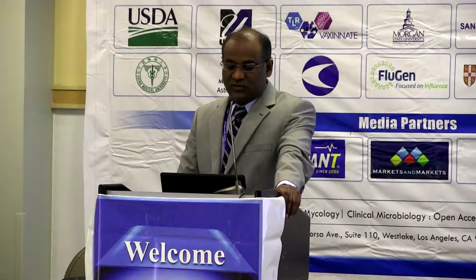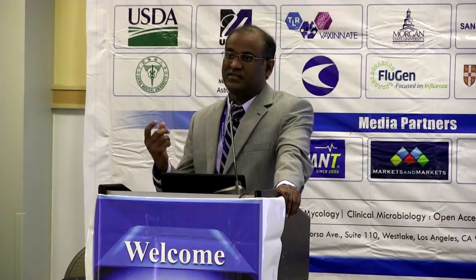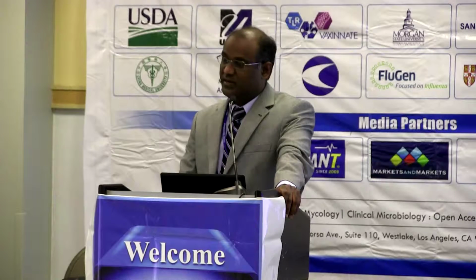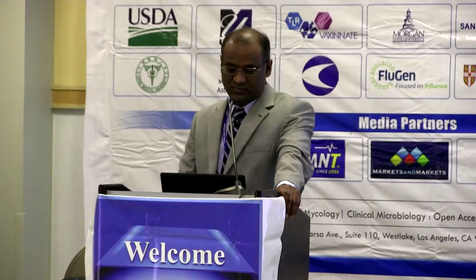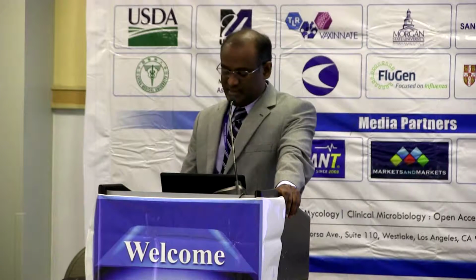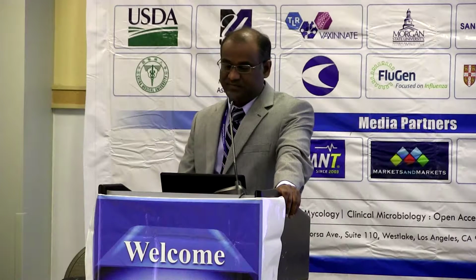Now, there are also cryopreserved shell vials that can be used on demand. So you could get these shell vials, freeze them, and pull them out of the freezer as you need them. And they too have very good sensitivity and performance criteria. Now, these are options for small-volume laboratories, and still the diagnosis is in days and not in hours.